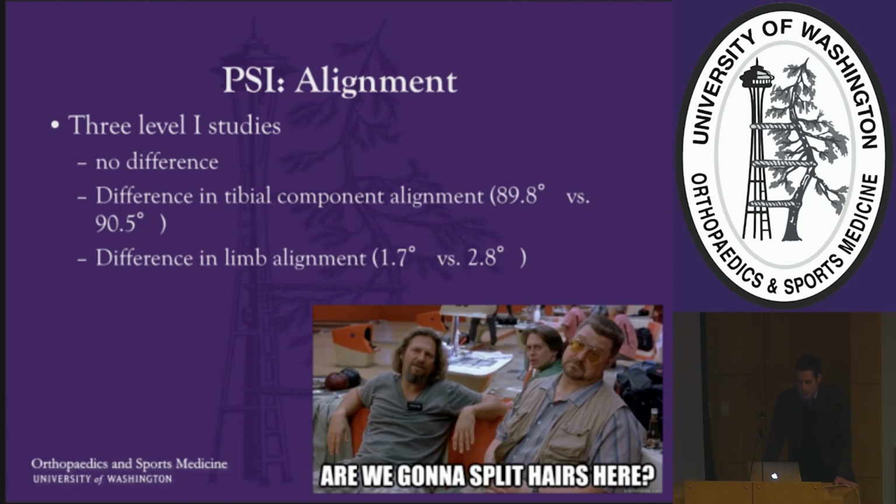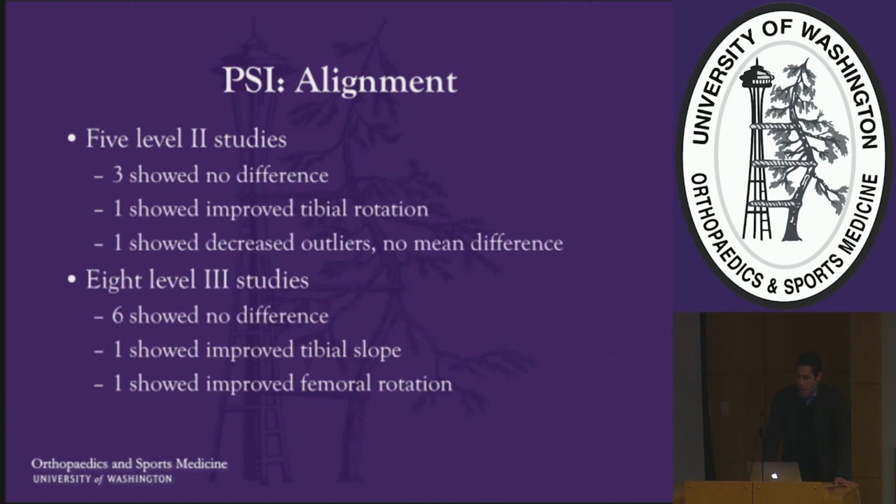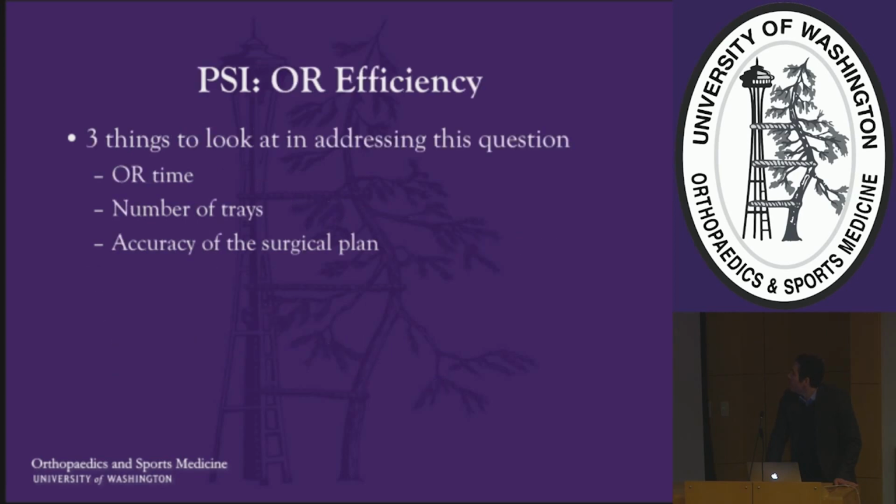So the level 2 and 3 studies also failed to show significant difference in the majority of instances. OR efficiency. So we looked at this as it relates to 3 questions.